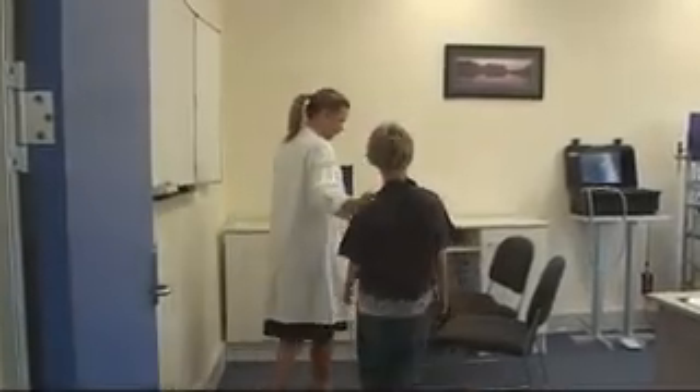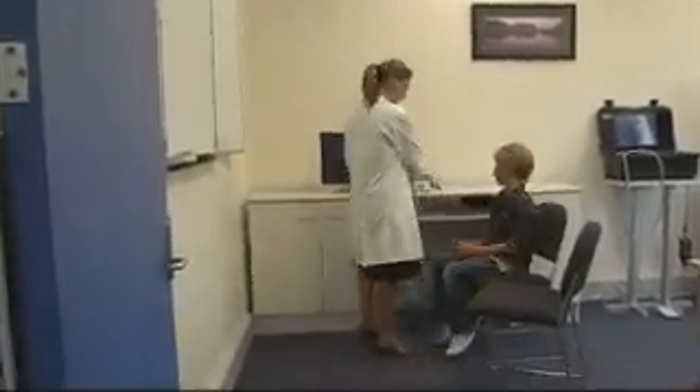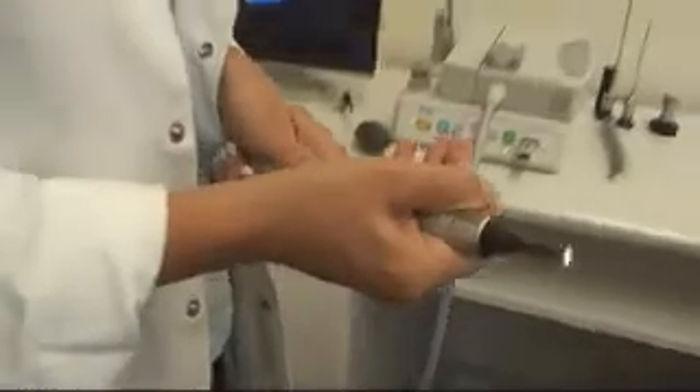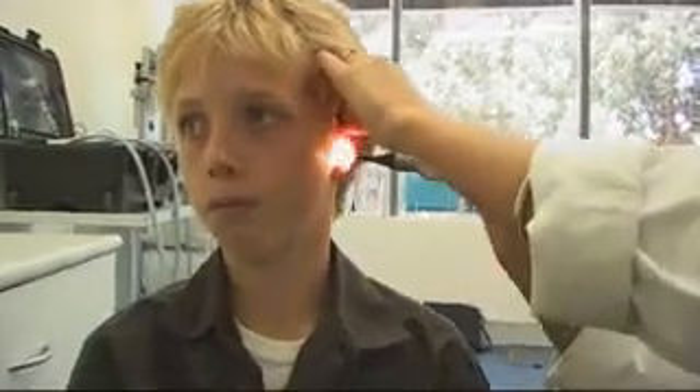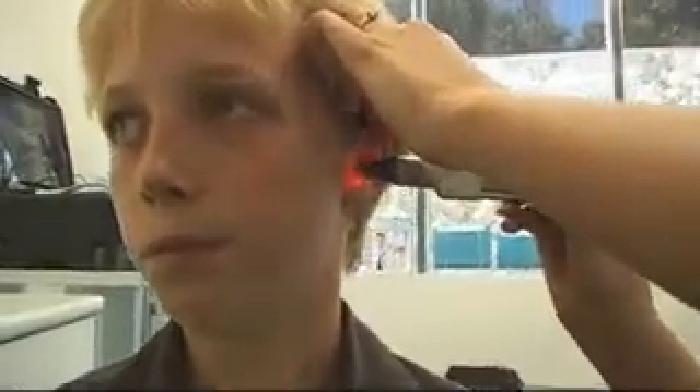The Flexiscope Microvision E&T camera uses the latest technology in miniature electronics and precision optics to produce high resolution, crystal clear diagnostic images. The Microvision is the perfect multi-purpose camera for a range of applications including hospital based clinical examinations, private practitioners rooms, regional and remote area health screening, and telehealth applications.